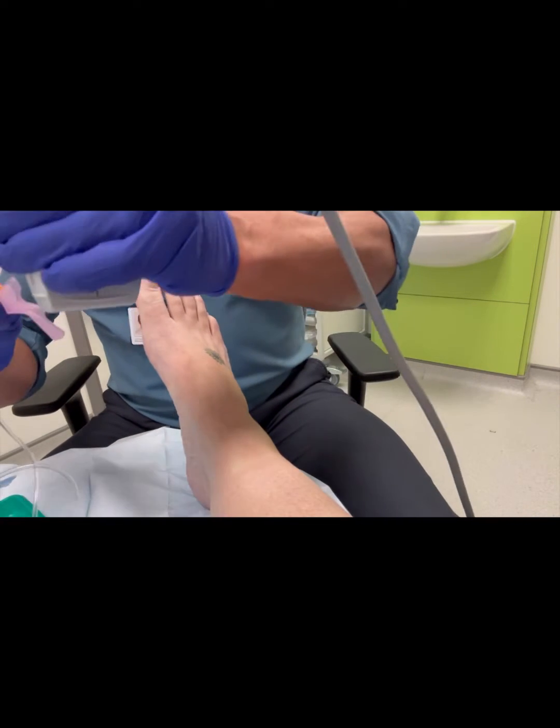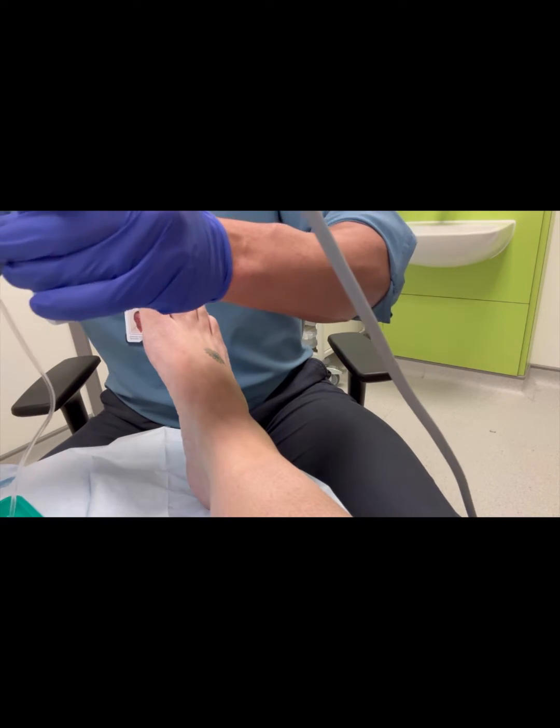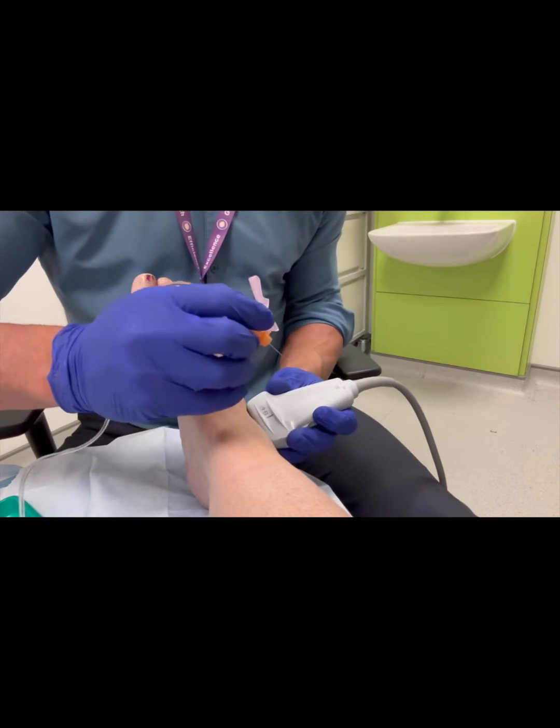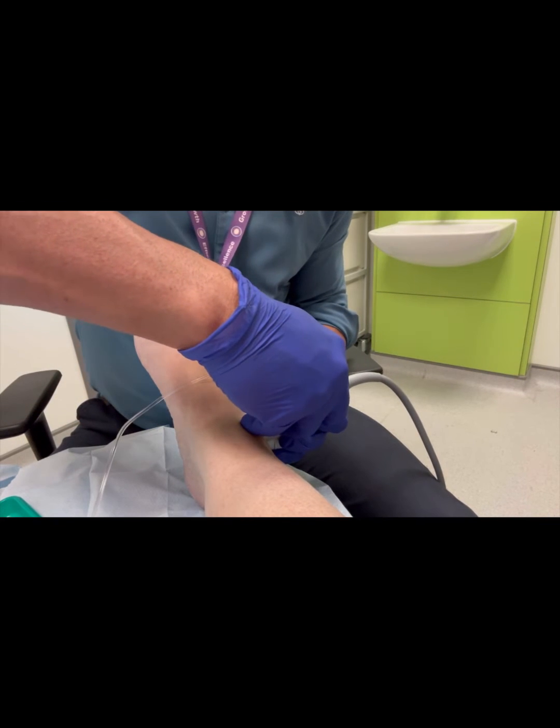This is a common spot for osteoarthritis, especially following trauma, and this is a diagnosis usually made by MRI scan.